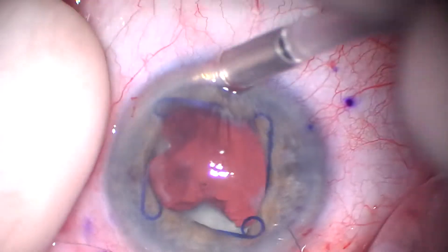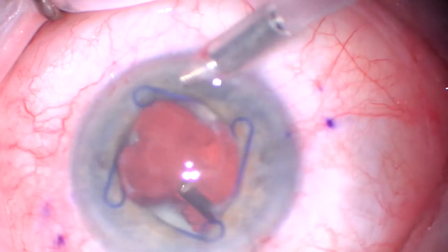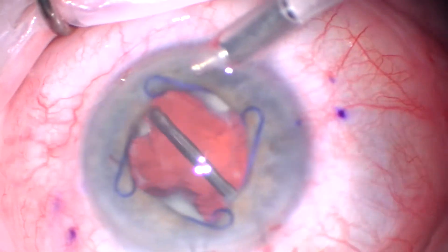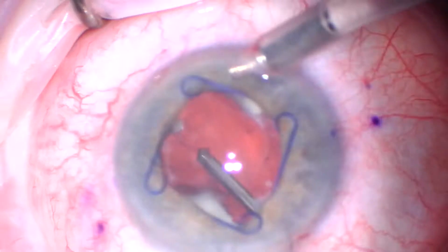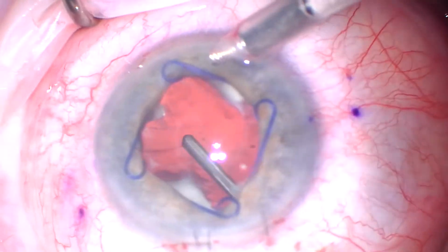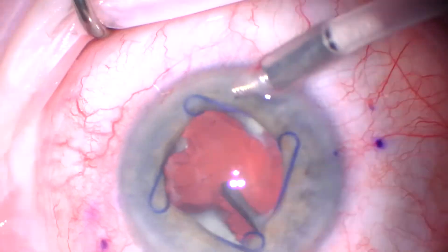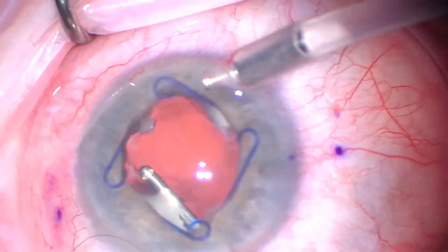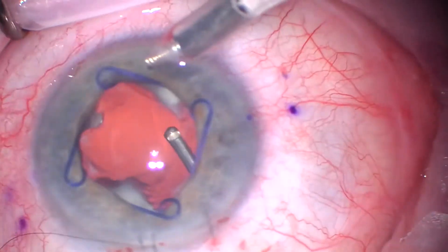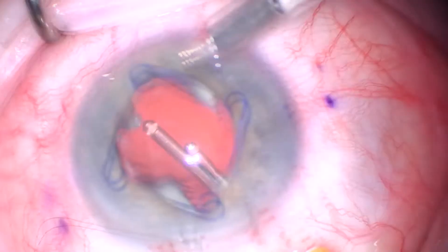Here we're placing a 23-gauge Lewicki anterior chamber maintainer. Going to do some core vitrectomy here — I've sped this up just because sitting there doing a bunch of vitrectomy is kind of boring to watch. Obviously I'm an anterior segment surgeon, not a retina specialist, so I'm going to go about vitrectomy slightly differently here, mostly focusing anteriorly. I do not vitrectomy past where I can visualize.